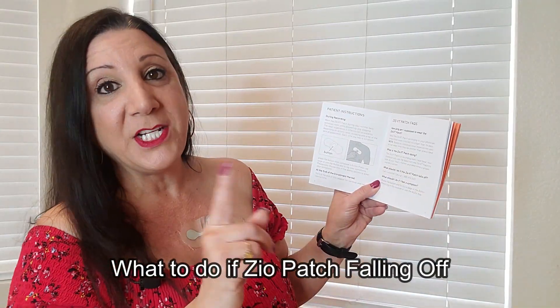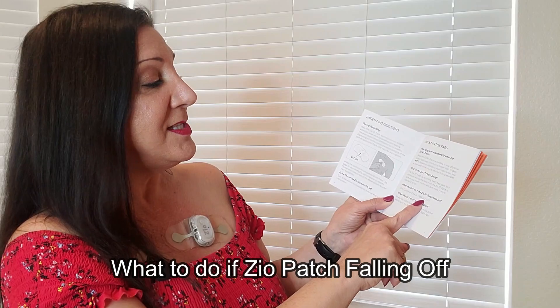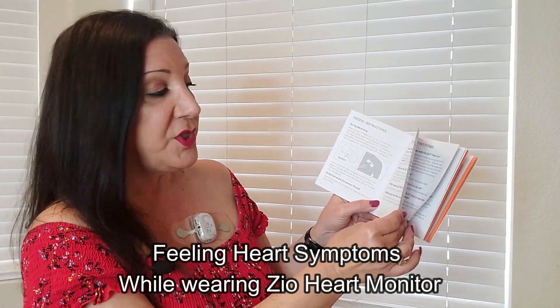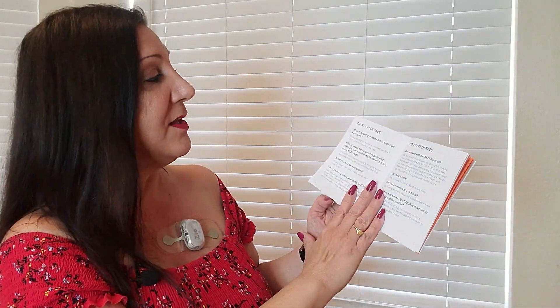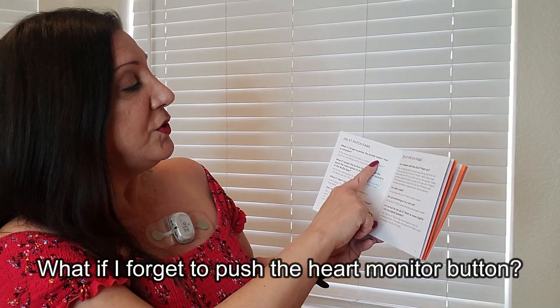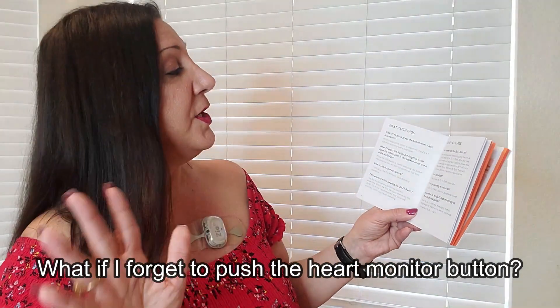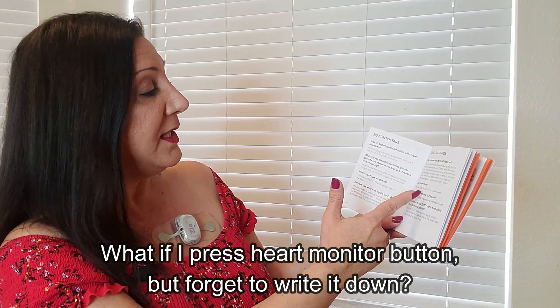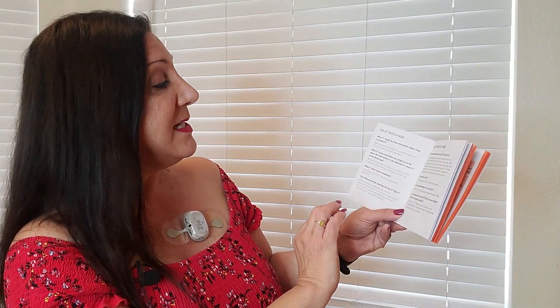If it falls off, make sure to call 1-888-693-2401. When you feel symptoms, push the button and write it in your button press log. What if you forget to push the button? Don't worry — pressing the button is important, but the Zio XT patch is recording every heartbeat. And if you press the button but forget to write it down, pressing the button is still sufficient since it indicates that you felt your symptoms at that time.